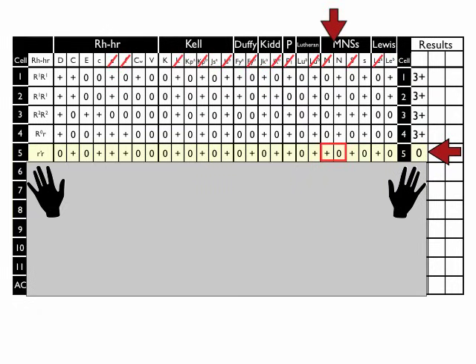It's somewhat true in RH as well. But in general, the only one that people consider relatively acceptable to do a cross-off on when you don't have a double dose is big K. So big K is a hugely important antigen. It's really, really rare to find big K positive, little k negative cells. Most panels won't have those. So most immunohematologists are okay with doing that single dose rule out with a big K. I'm not going to show you that right now, but just wanted to let you know that.